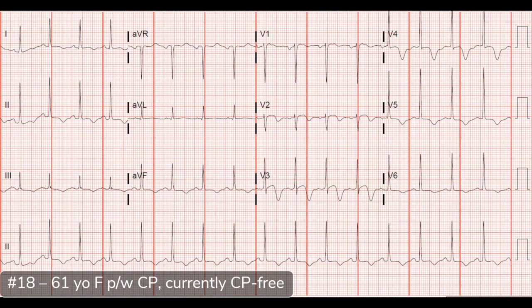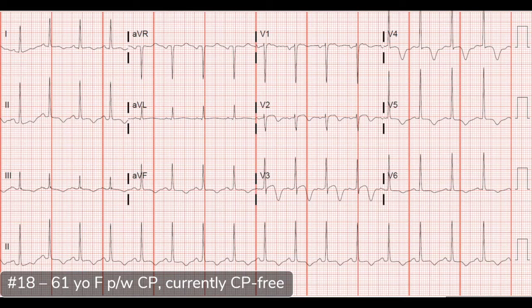With this ECG combined with the story — chest pain that is now absent — this is most consistent with Wellens syndrome. This was a classic Wellens case. She went on to get a cath after transfer to another hospital since our county facility doesn't have a cath lab. They found a 95% stenosis of the proximal LAD, and she was successfully stented.